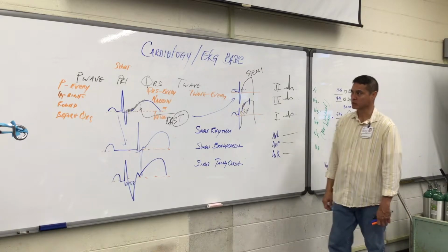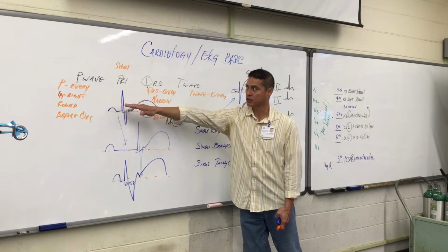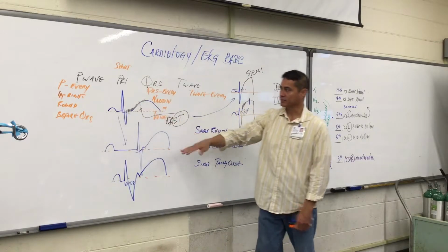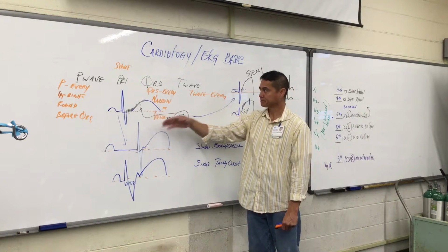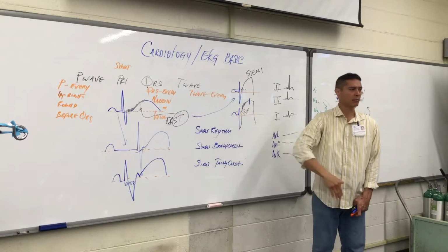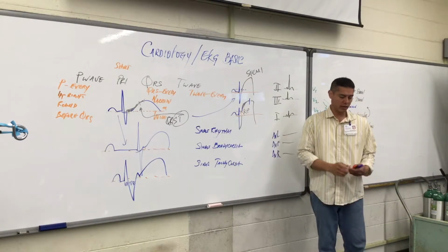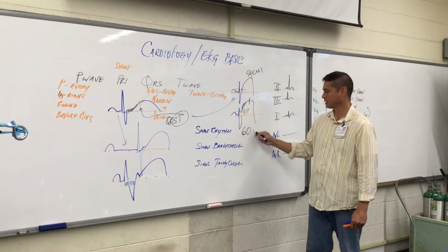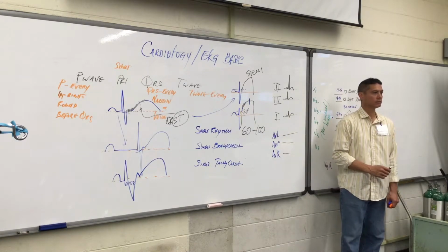All right, so going back to reading the EKG, we've got the P wave before every QRS, a PRI if we have the P wave, then we have a QRS that can be narrow or wide. Again, we just know it has to be there. And then the T wave. Now if we see that all the time, redoing itself over and over, if it's between the rate of 60 and 100, we would call that sinus rhythm.